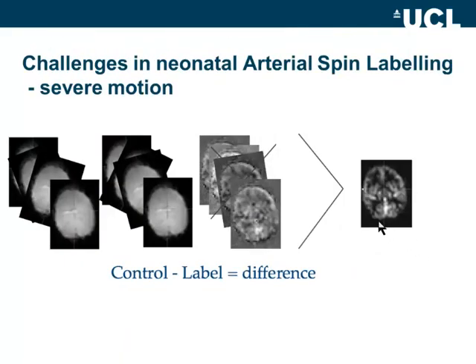Now, the biggest problem when you're doing this is that babies have a tendency to move. The very sick babies that are intubated and under sedation won't move, of course. But quite a lot of them will be scanned without sedation, so we feed them and wrap them and then they're all cozy and fall asleep. Of course, when they get into a scanner and hear the noise of the scanner, quite a few will wake up in the middle of the experiment. On most clinical scanners, you will just directly get an average.